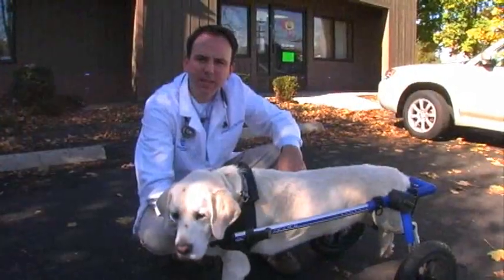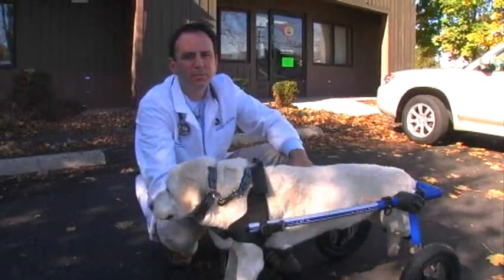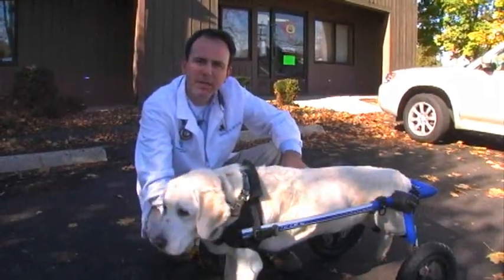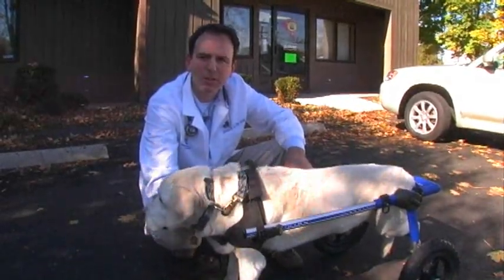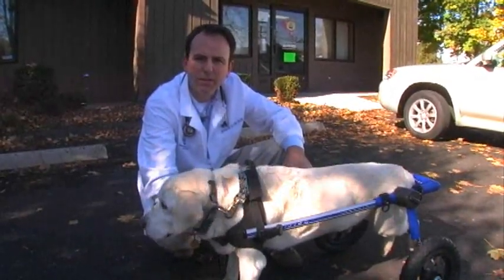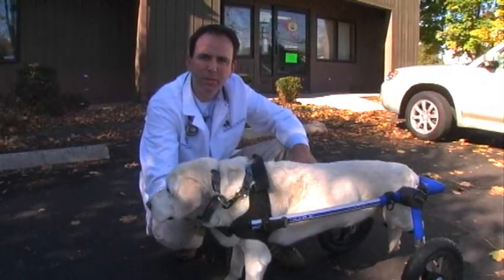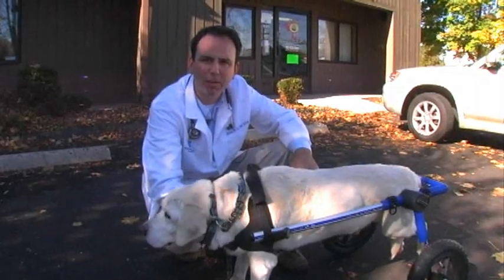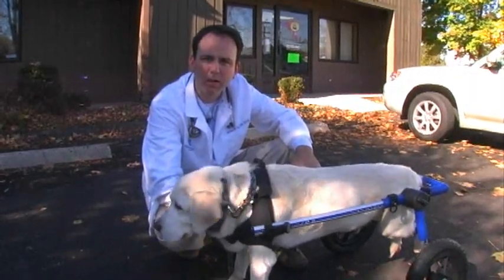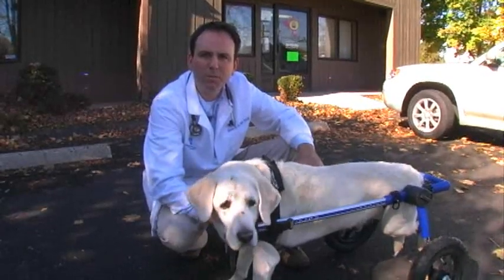Now that we have Sonny outside for the first time in his cart, I want to clarify one large misconception that people have. They think a lot of times that once they get their dog in a wheelchair, they're going to just adjust to it immediately and take off and start running. Most of the time that's not the case. They have to get used to it. So what I'm going to do is, the first time with Sonny outside, I'm only going to leave him in the cart for a minute. And then maybe tomorrow I'm going to shoot for 2 minutes.